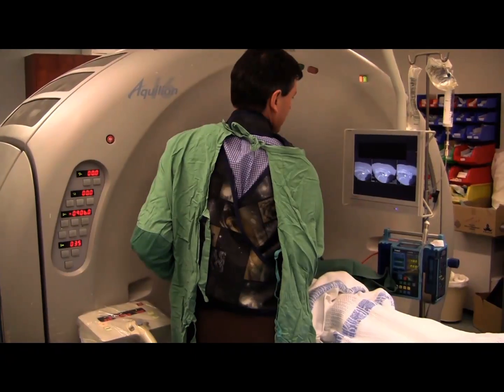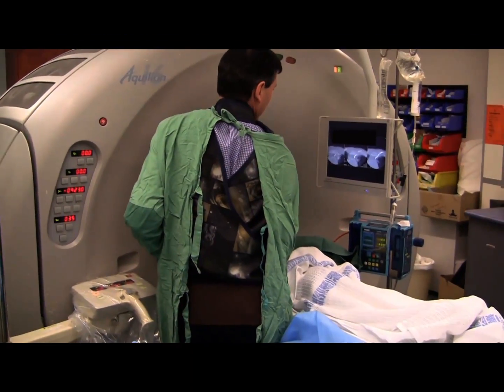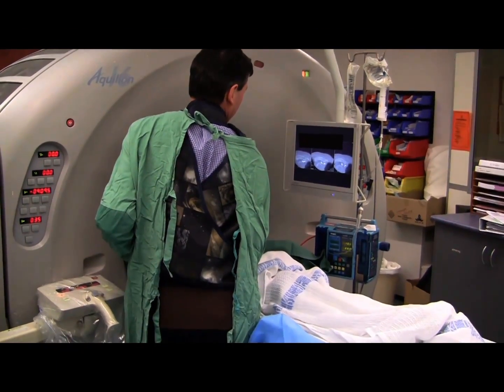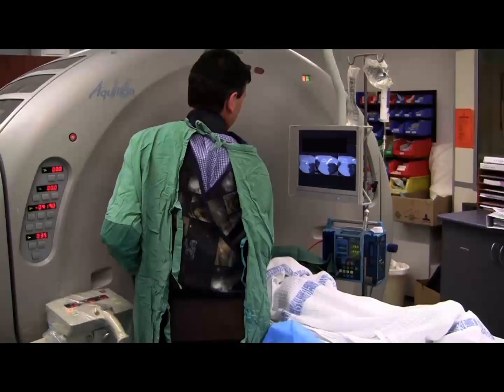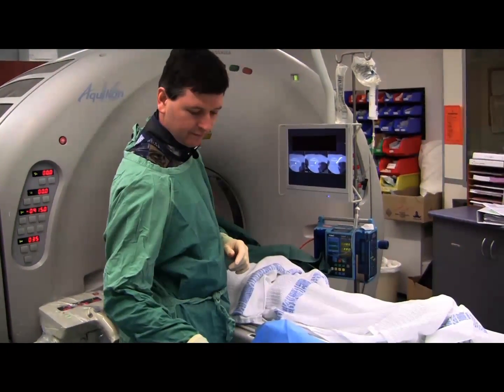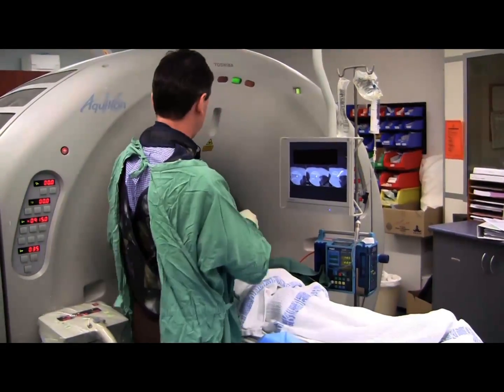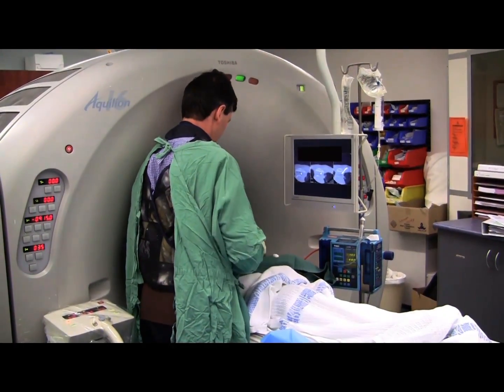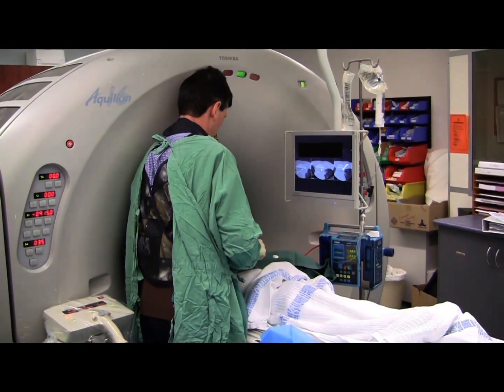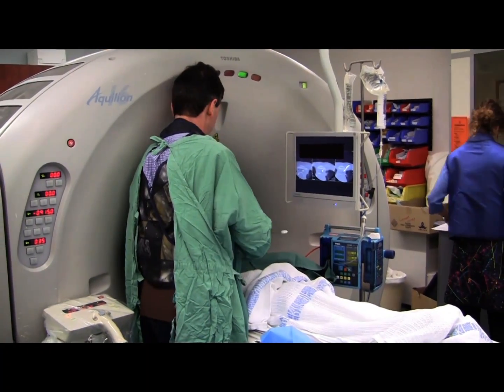Just unlatch the table. Okay, I'm not quite happy with that. We need to put a bit more drain in. What we're going to do is just reintroduce a bit of guide wire and a bit of stiffener and just push the drain a little bit further in.